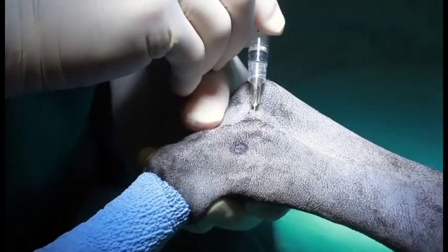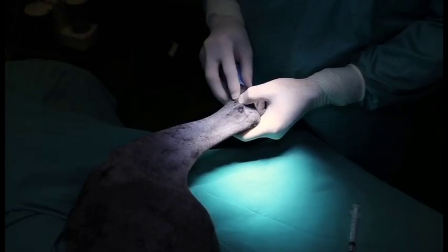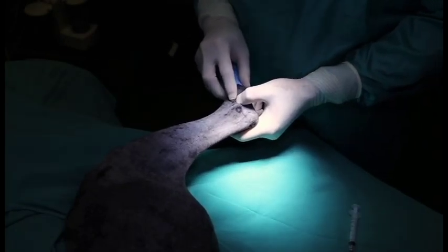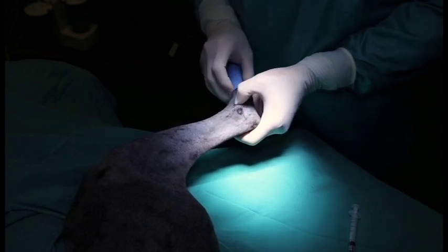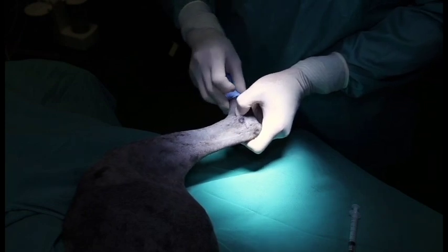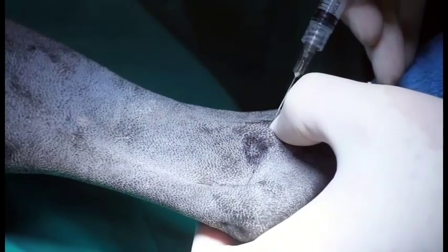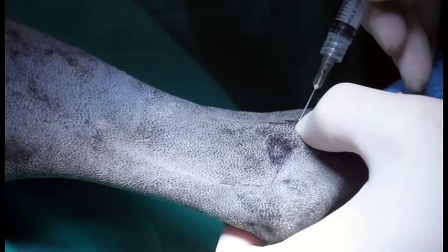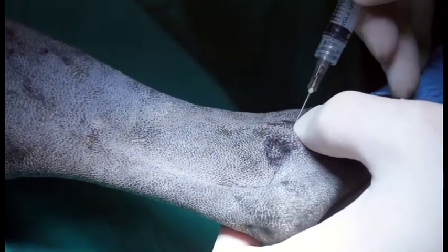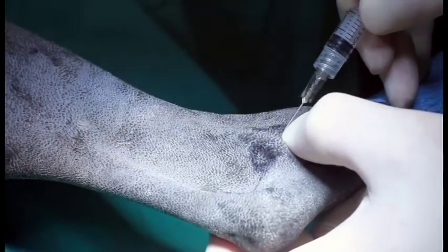The joint is very shallow so you don't have to penetrate very far. For the cranial insertion site, again you can flex and extend the hock and there will be a smaller depression that you can palpate with your thumb, with a little less flexion of the joint. Angle slightly upward and medially into the cranial aspect of the joint, and you don't have to go very far because this joint is very shallow.